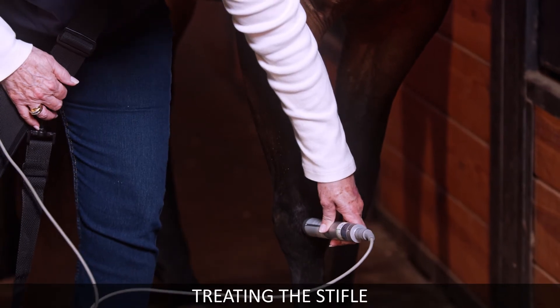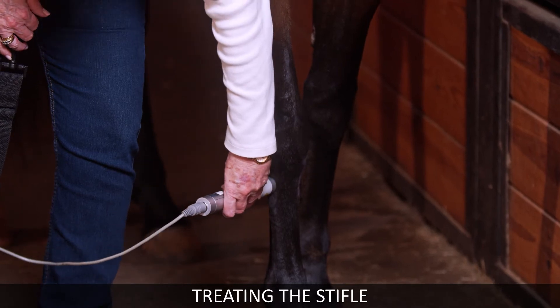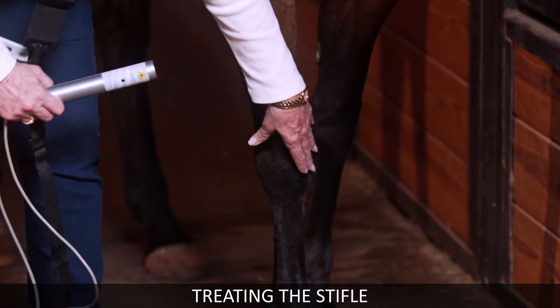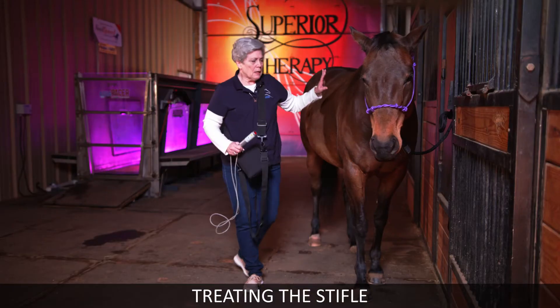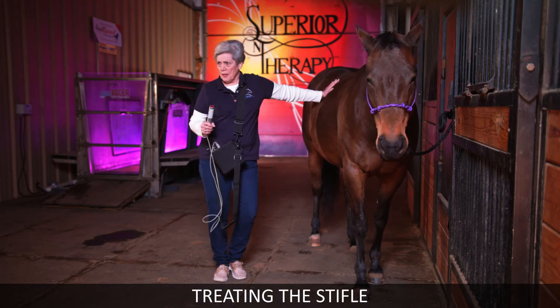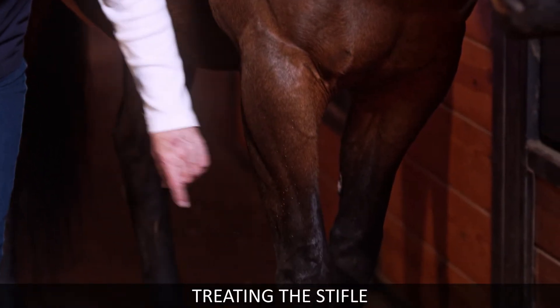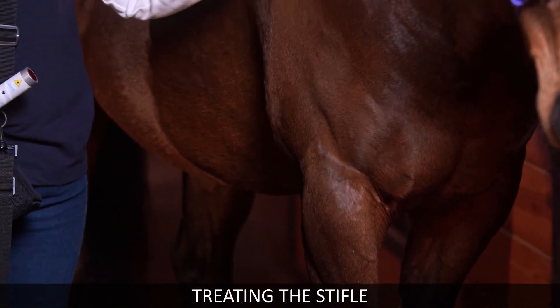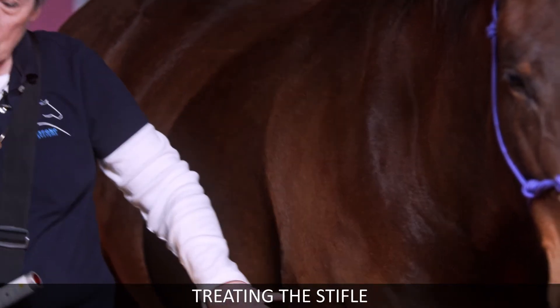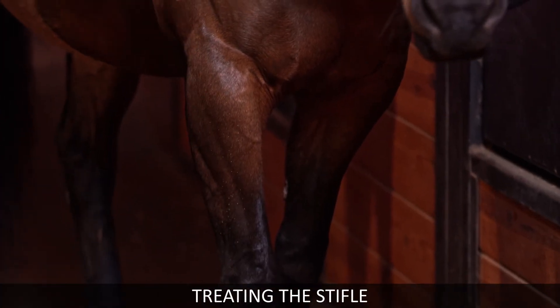Going down the front, down the side, two beeps in each spot, down the back, and on the other side. If you've got a real problem, treat longer than that — but this is just for general soreness in that area. If you've got swelling, you can use the wide head first, as it's gentler. Treat around the swelling first to open up the capillary system and let all that out, then treat on it.